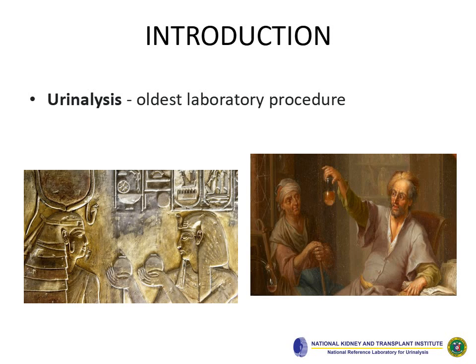Urinalysis is regarded as the oldest laboratory procedure, as evidenced by drawings of cavemen and Egyptian hieroglyphics. Diagnostic information was obtained from such basic observations of color, turbidity, odor, volume, viscosity, and even sweetness. But please do not attempt to taste urine.